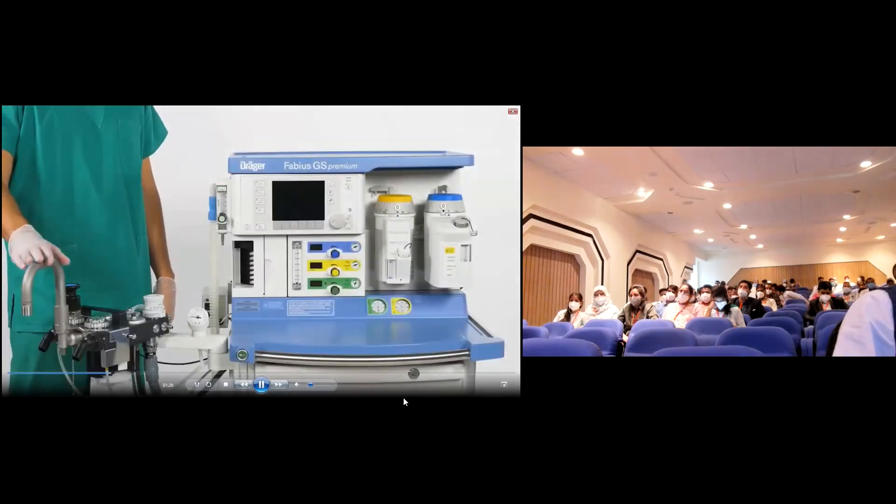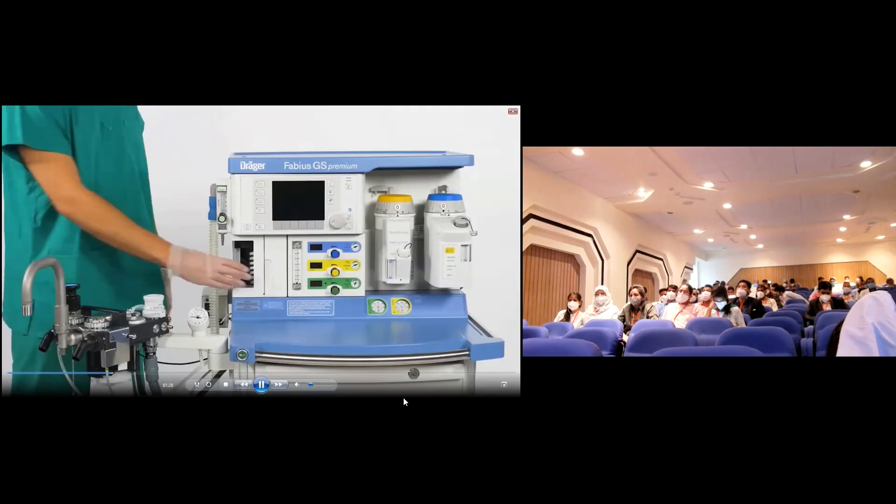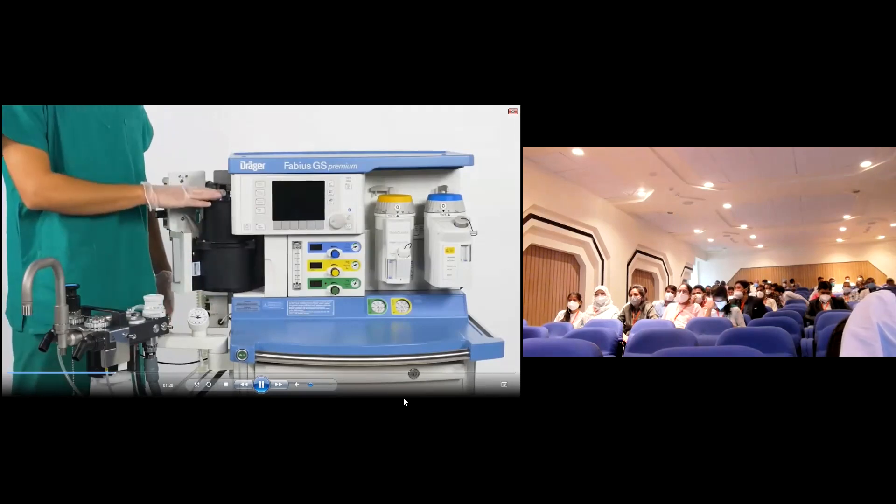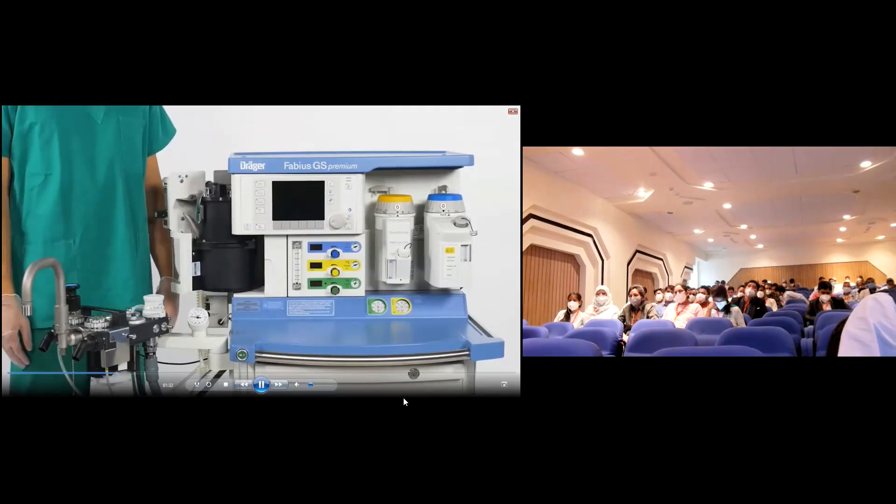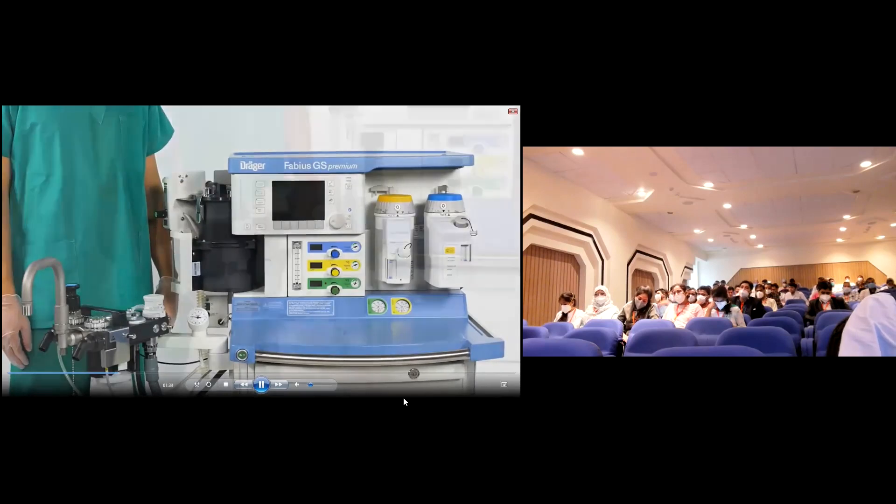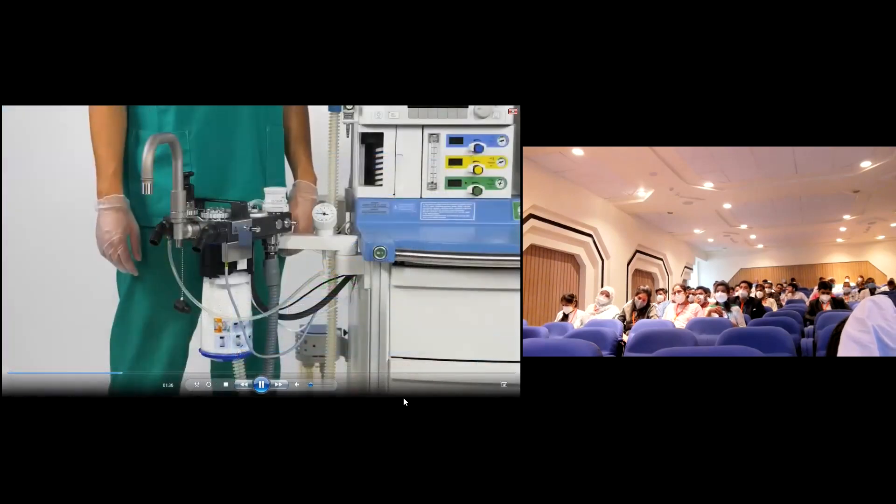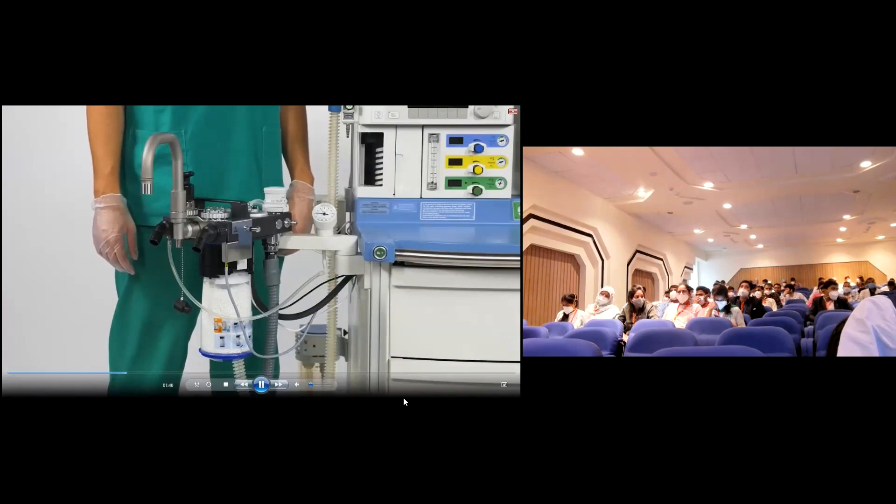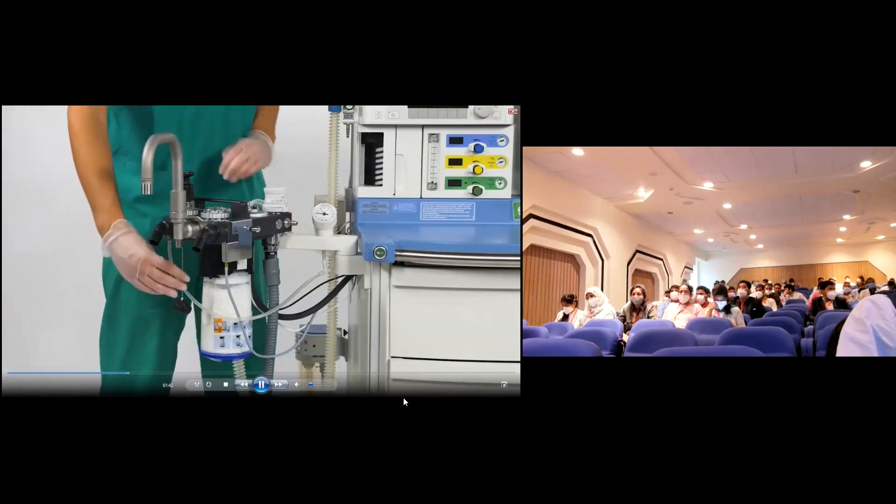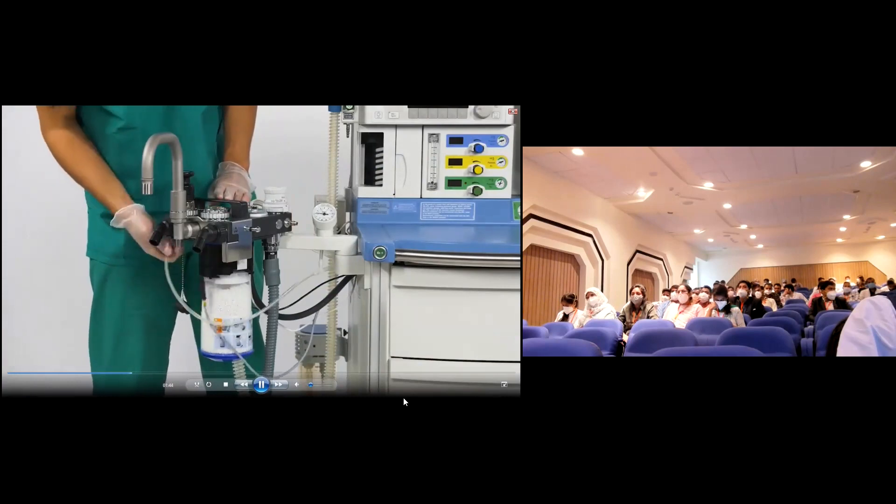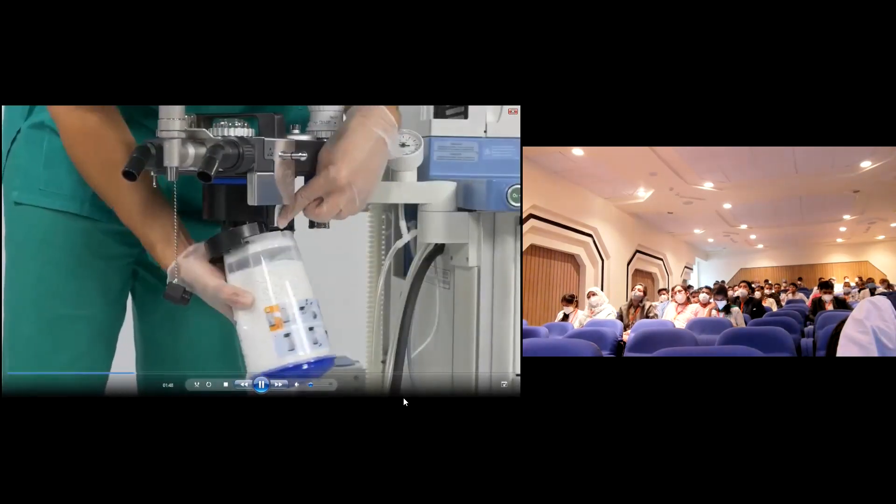All components of the Fabius GS Premium that are in direct contact with patient gases can be reprocessed using a cleaning and disinfection machine or manual disinfection. We will now guide you through the disassembly procedure which can be performed without any tools. The breathing system is called COSY, short for Compact Breathing System. First, disconnect all cables and hoses from the COSY and remove the CO2 absorber.